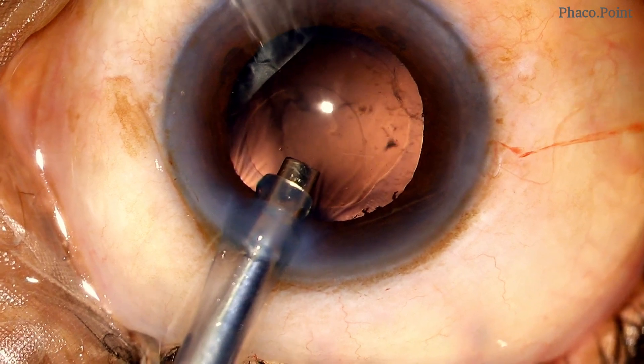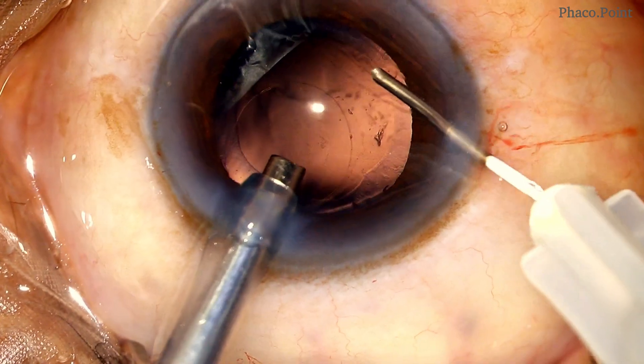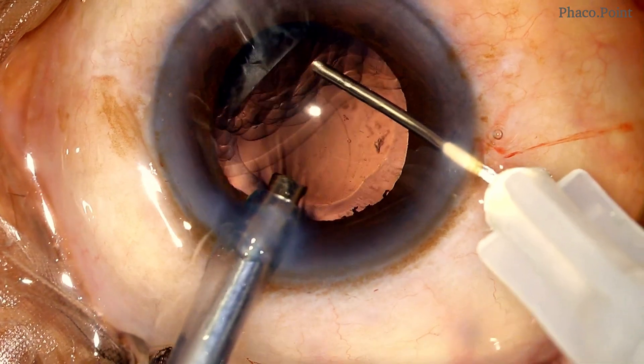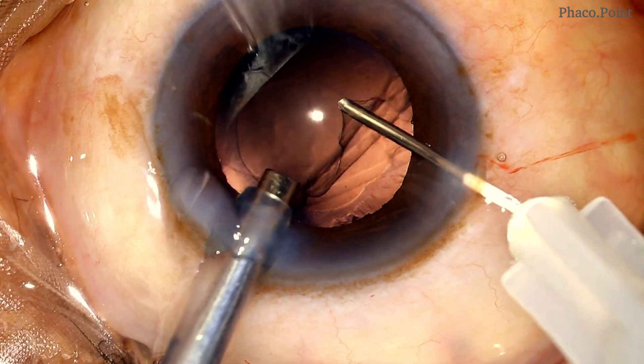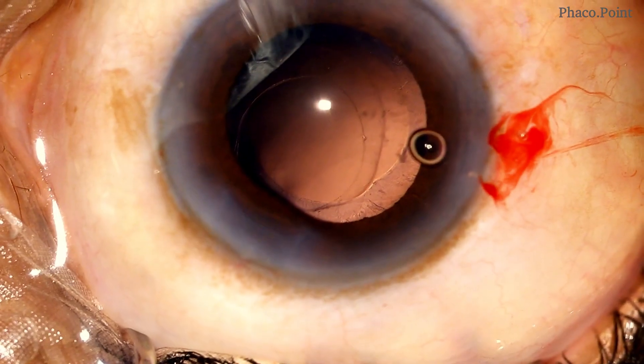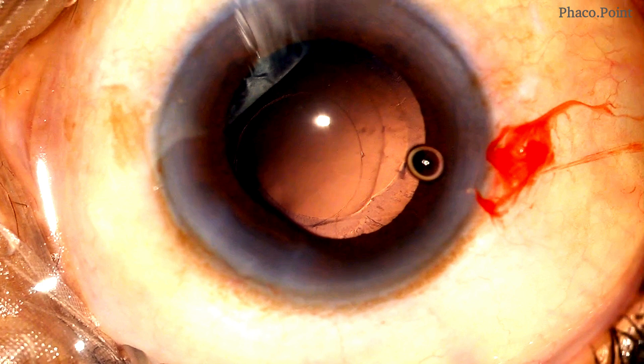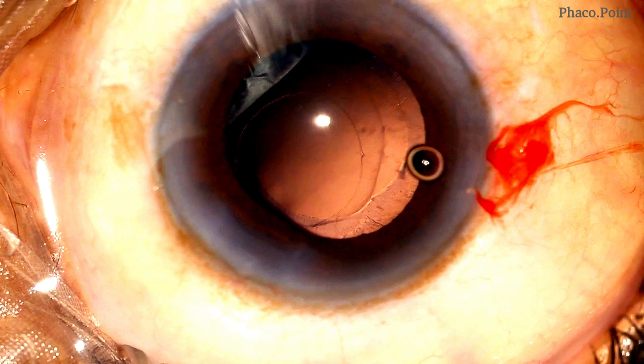Without reflexly removing the phaco probe, the second instrument is removed from the eye, a viscofluid exchange is done, and then the phaco probe is removed from the eye. This prevents any further vitreous herniation. As you can see, there has been no enlargement of this circular tear in the posterior capsule.